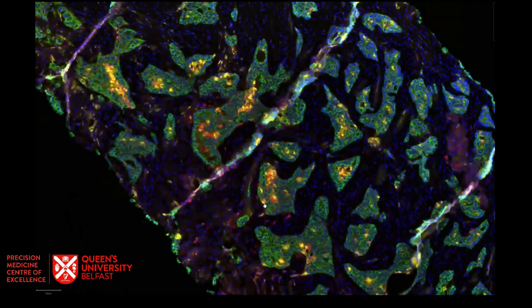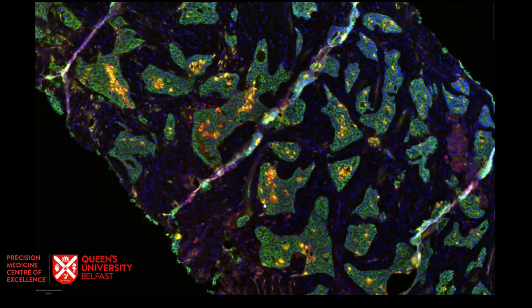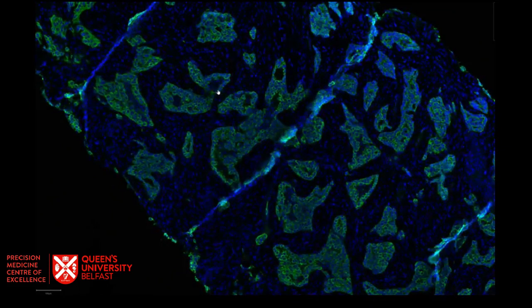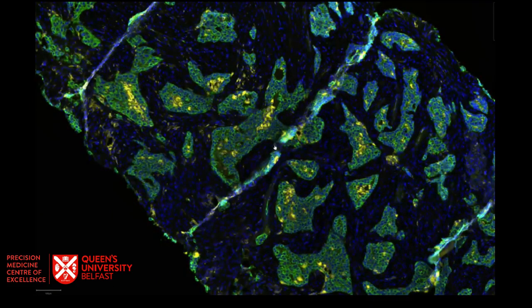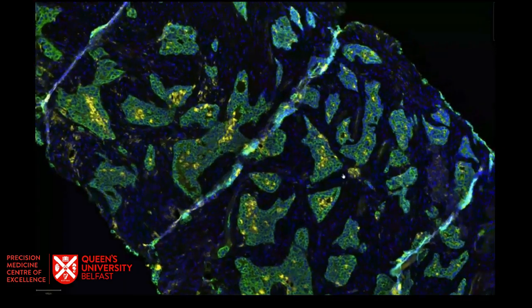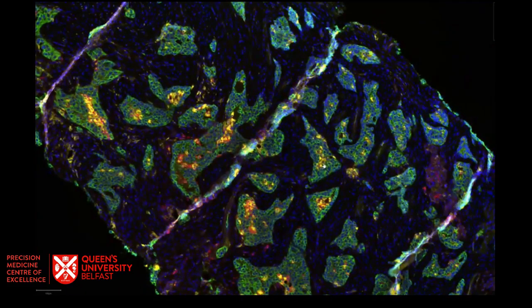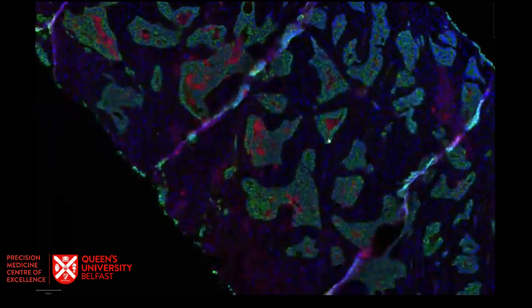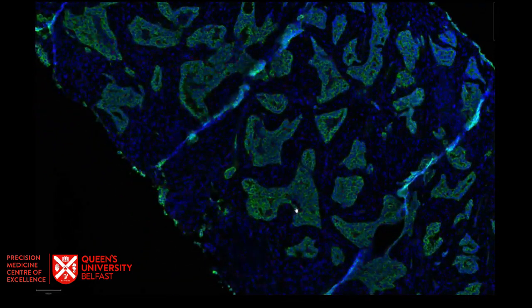Now, a lot of people say this is all very well and good, and it's at this point they say, well, fair enough, but you still need a pathologist to sit at the screen and assess these cases, and that's absolutely true, you do. So one of the things that we wanted to do was try bring image analysis in the same way we did to the IHC slides to the multiplex slides.